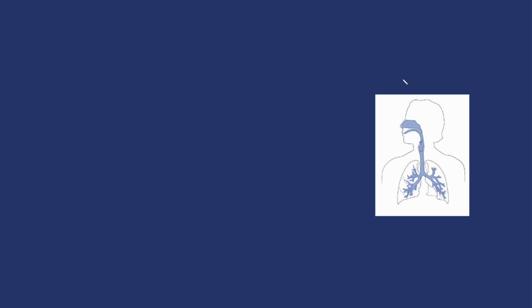Before we go over how capnography works, we go into how the respiratory system works a little bit and how the respirations work. Here we have this person, and we have these highlighted blue areas. We have our nasopharynx up here, our oropharynx going into the trachea, into the bronchioles, to both the lungs. The important concept here to remember is that these whole areas, I'm going to shade these in a little bit, all of this here does not deal with perfusion.